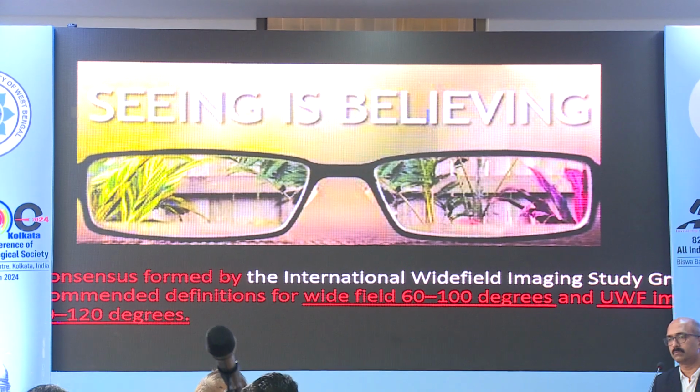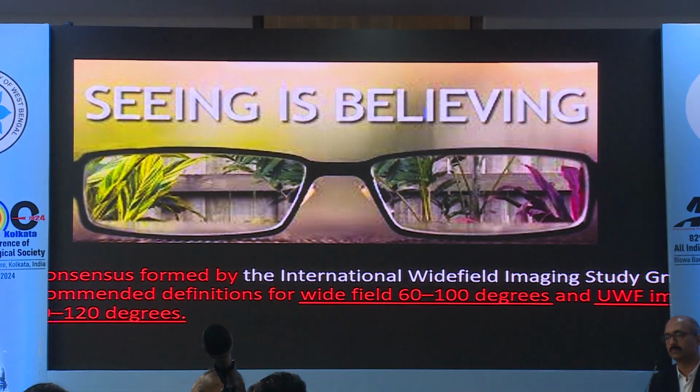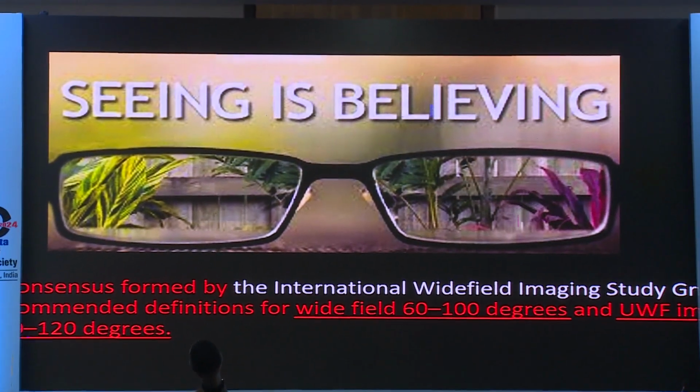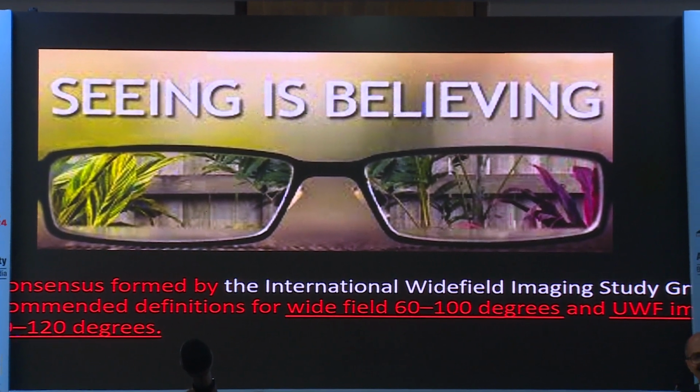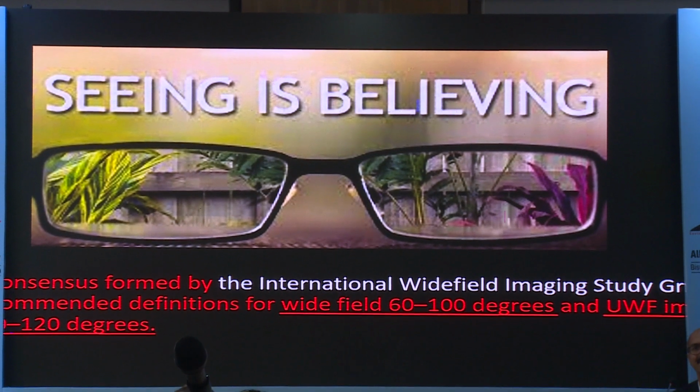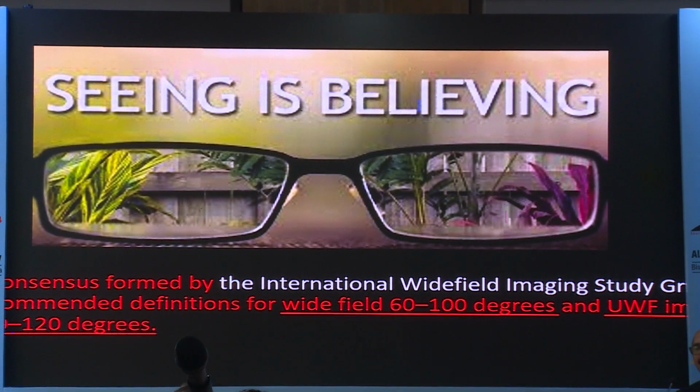I think Dr. Ajay Arora already told us that the International Widefield Imaging Study Group recommended widefield to be 60 to 100 degrees and ultra-widefield to be about 110 to 120 degrees. And seeing is believing. Till you see it, you can't believe it, you can't treat it. And I love the acronym of Dr. Shane, that DREAM. Till we document it, educate our patients, and reinforce it, we cannot treat the pathology and cannot convince our patients to get treated. So I think that's an amazing tip from today's talk.